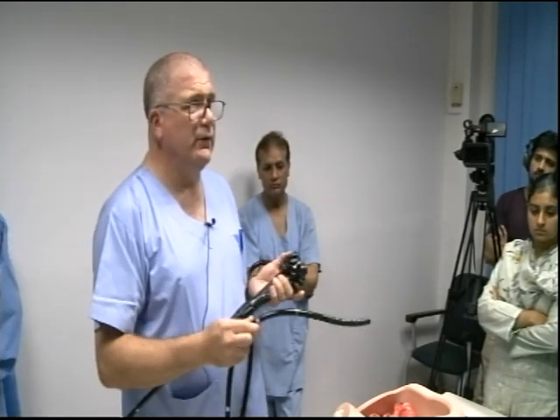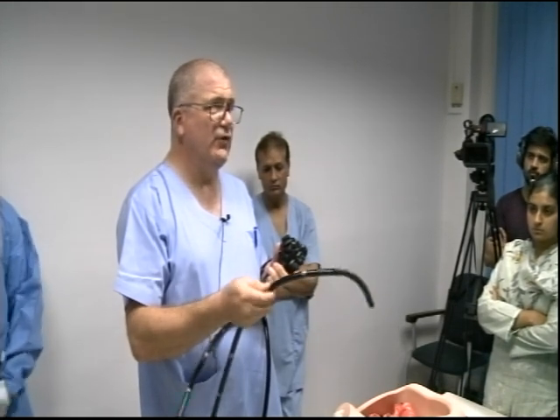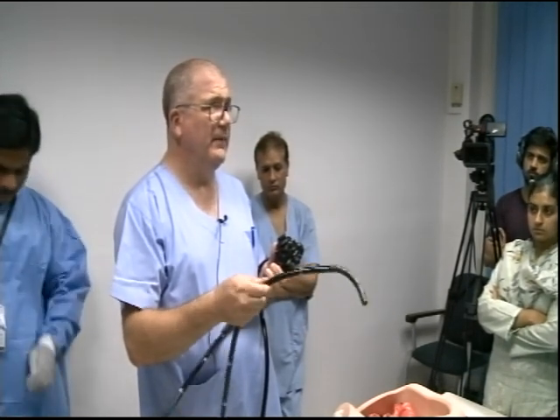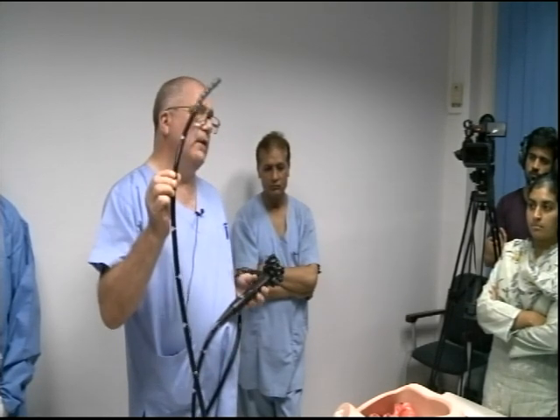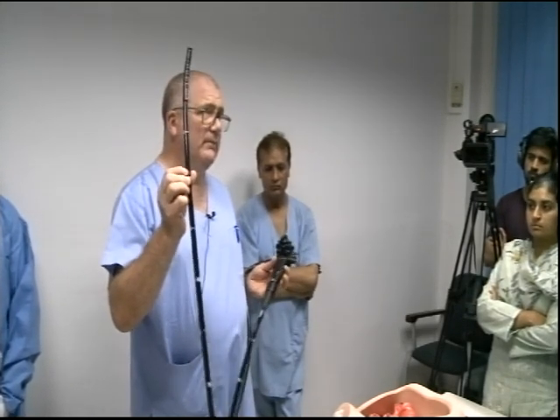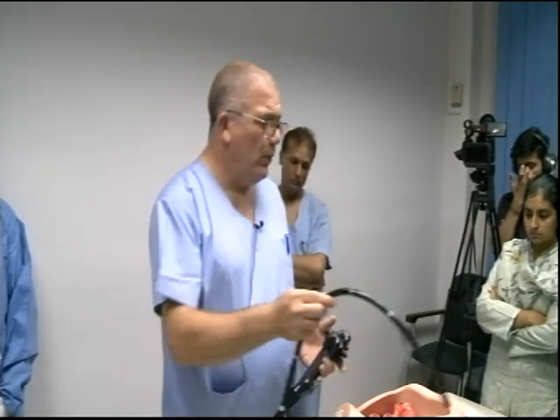So a lot of people get confused. Why is it doing what it's doing? I cannot understand why it's looking to the left when I'm putting clockwise torque on. And it's because of the position of the tip of the scope. Even though you're looking up, in that position it wants to go left, or wants to go right. So it helps you to understand the concept of torque steering.